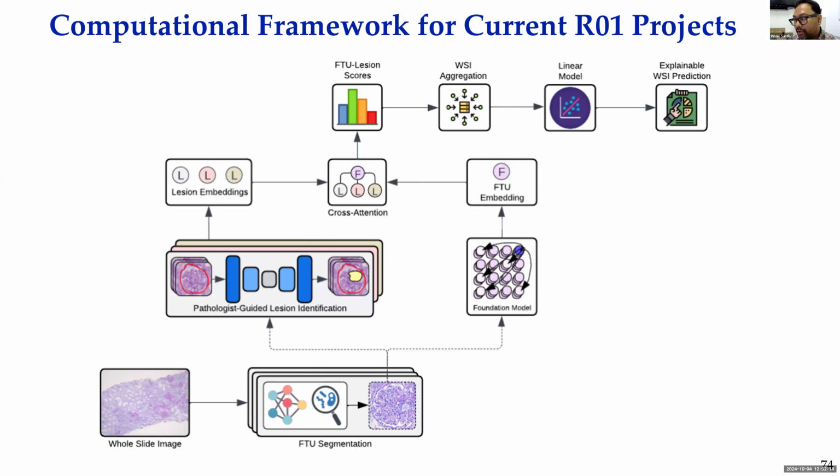to solve this kind of problem, where we use histology images as well as pathologist guidance, where someone like you, right, or a user, can interact with this system. My goal is to define a disease by saying, for example, in diabetes, someone mentioned that 2 out of 15 patients always cannot be explained. I wanted to say how diabetic this person is, how much disease you have, with a vector. So it's a continuum. That's what we are trying to model, right?